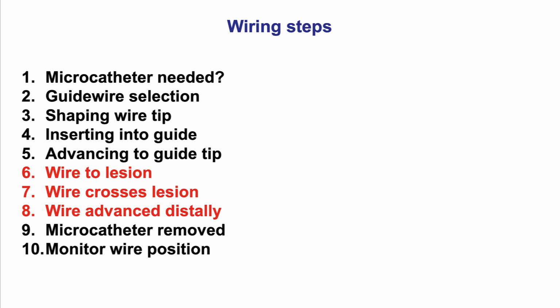So in summary, these are 10 core principles applying to advancing a guide wire to the lesion, through the lesion, and distal to the lesion that I hope you can find helpful for your PCIs.